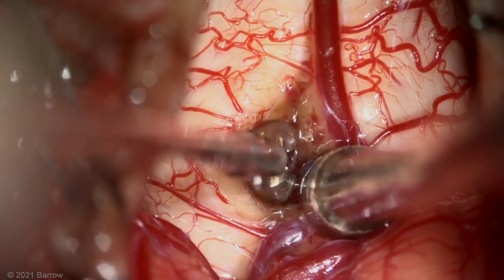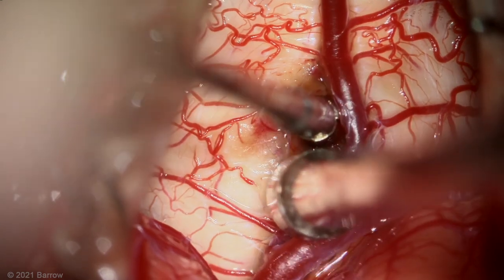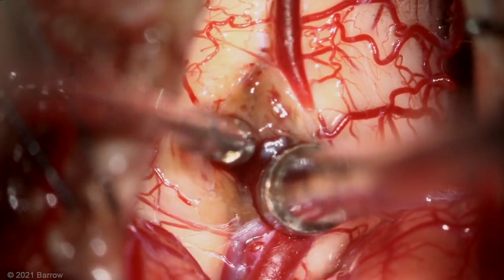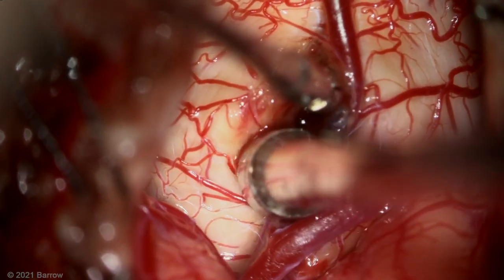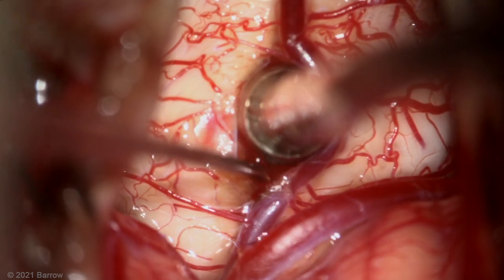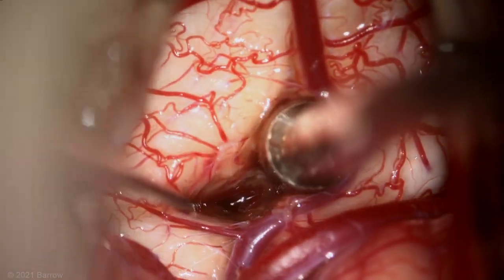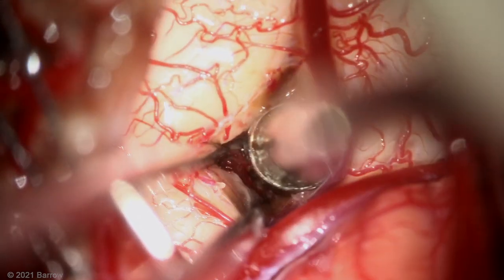From where we're located, you can see that we are adjacent to the gracilis and cuneate nuclei, so our dissection needs to be particularly gentle. By working inside the lesion at the beginning, we can help to develop these planes and not get into that really sensitive border.